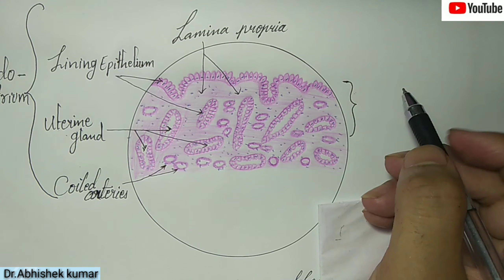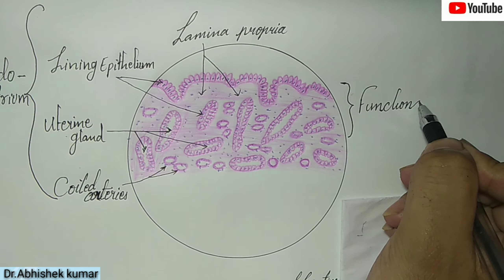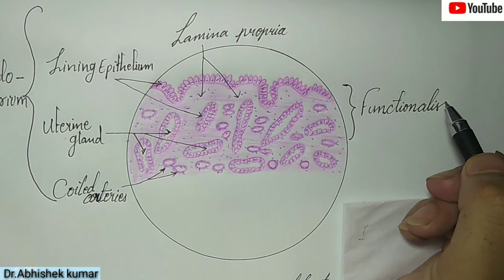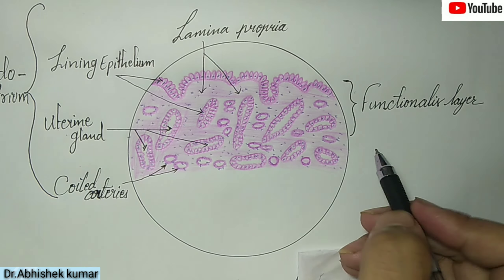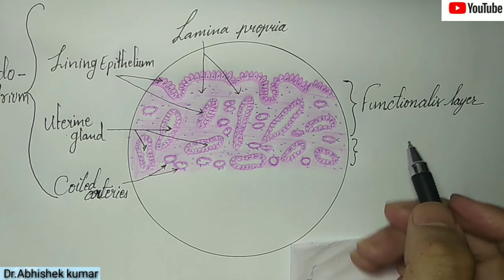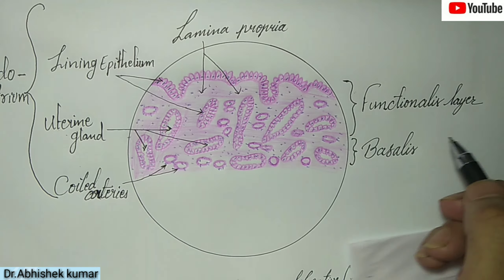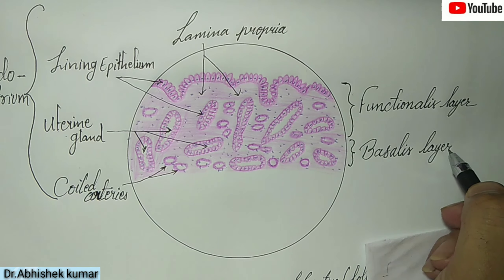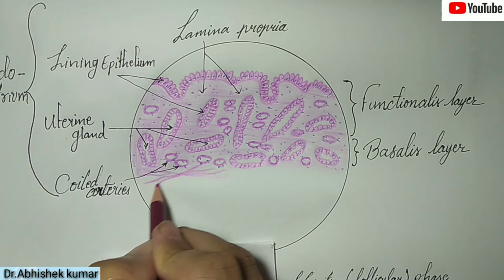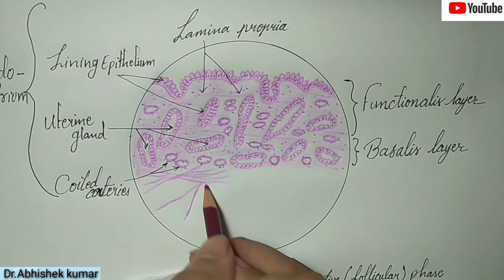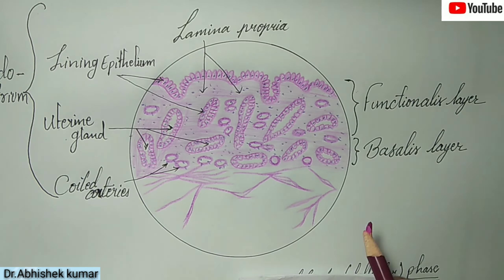This is the functionalis layer, and here is the basalis layer — these are the two layers of the endometrium: functionalis and basalis.